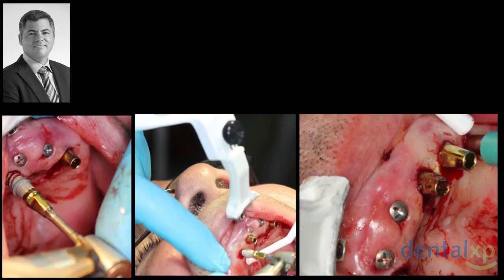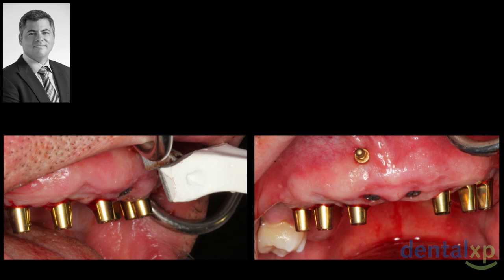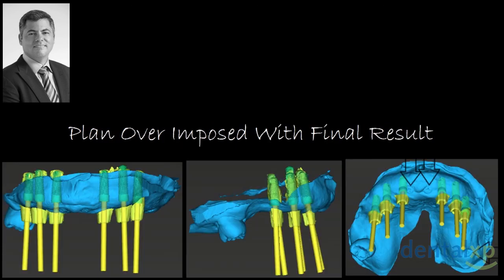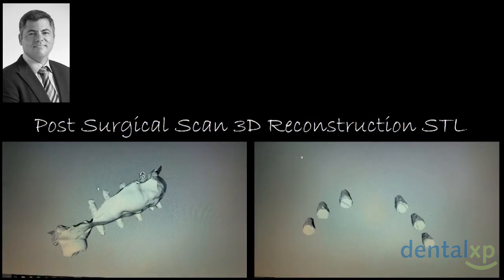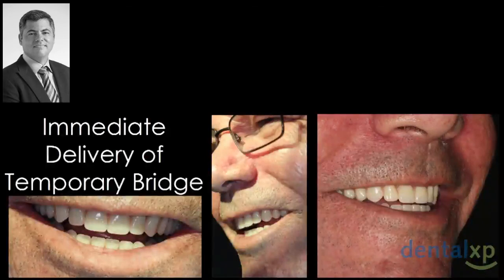Implant is calibrated, implant in position, and we have placed 6 implants, and this patient is now ready to get a temporary solution. Super minimally invasive case, very nice looking, very happy that I was able to get it. This is the post-surgical CBCT segmentation, looking exactly as planned, overimposition of the plan and the performance of the case, final result. And what you see now is the reconstruction of the STL, and the patient goes home super happy.